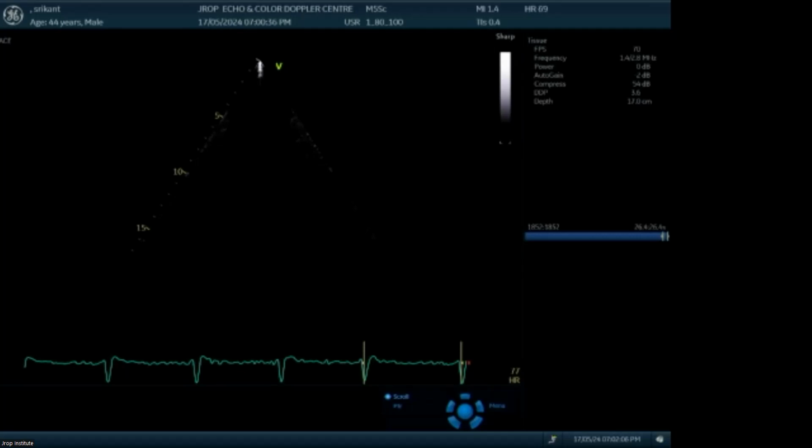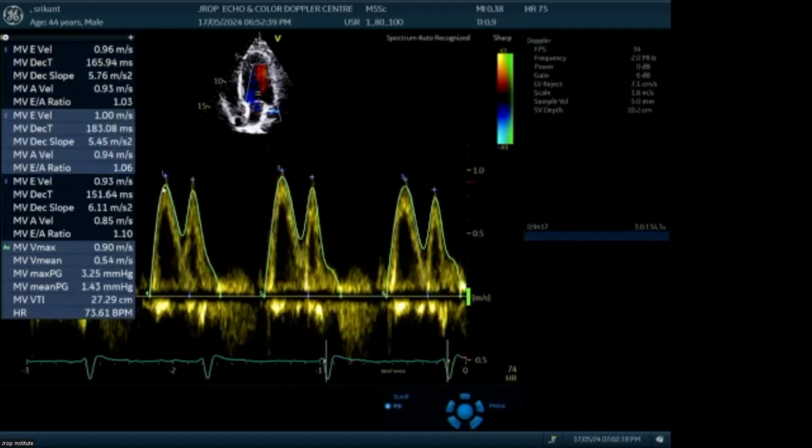Okay. Ravi Bala Mahajan: Sir, what is A wave and E wave? I don't understand, sir. This is the mitral flow pattern. Look at this mitral flow pattern over here. This wave is known as the E wave. Correct? Yes, sir. The other wave is known as the A wave. This is the E and A wave ratio. So this is the E wave, this is the A wave, in relation to the mitral valve. Sir, what does it denote, A wave and E wave?